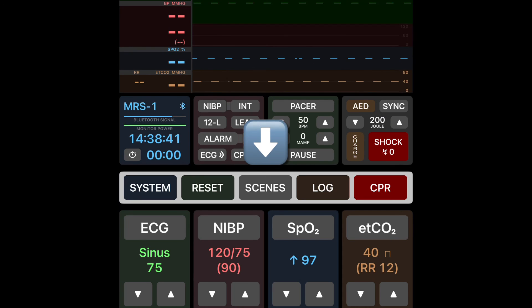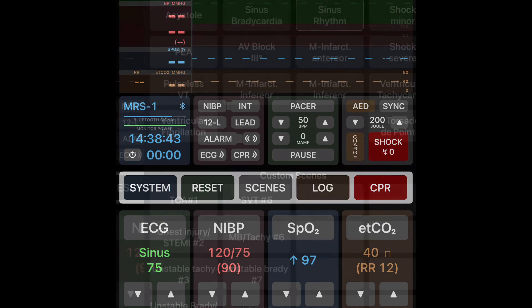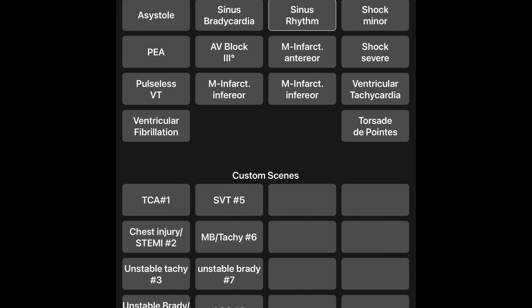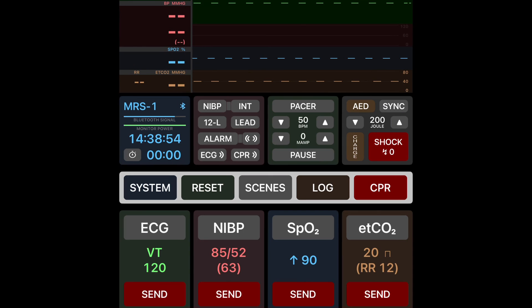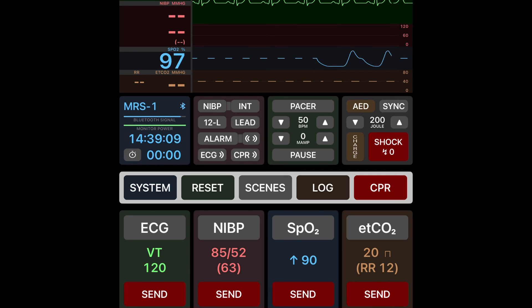Finally let's take a look at the scenes button. When you push the scenes button you'll have a selection of custom-made scenes as well as some quick buttons to go to scenes. When you push one it will pre-select ECG, NIBP, SpO2, and end-tidal CO2 numbers where you can quickly push send as you're ready to display them on the monitor.